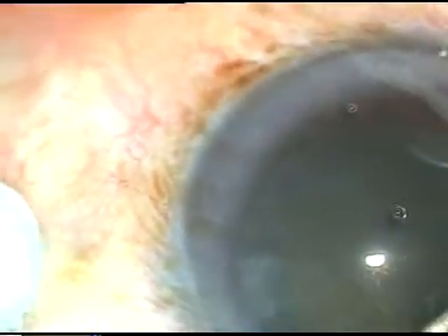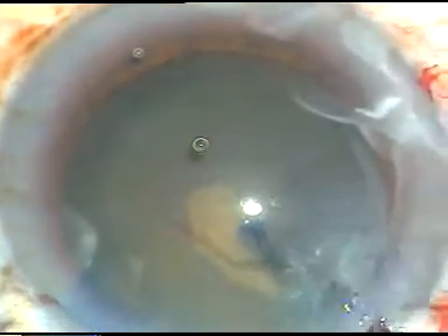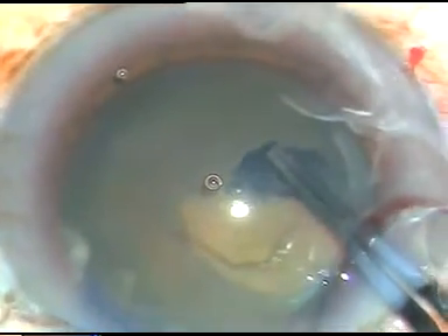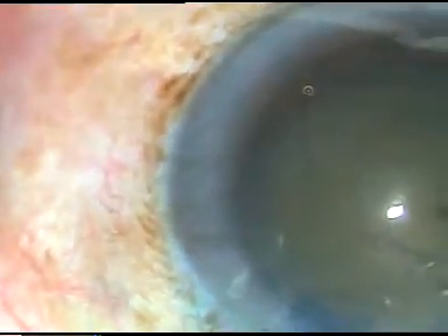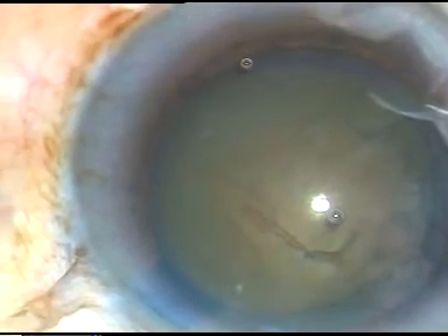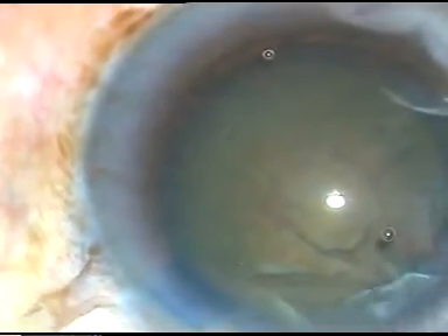This is the second case. See the rexis — the capsule has been incised with a cystotome. It's a 26-gauge disposable needle cystotome which I make myself. This is how I do the rexis with utrata forceps. The pupillary margin is guiding me to perform a beautiful, almost circular rexis. Now hydrodissection is done, and the nucleus is gently depressed and rotated.